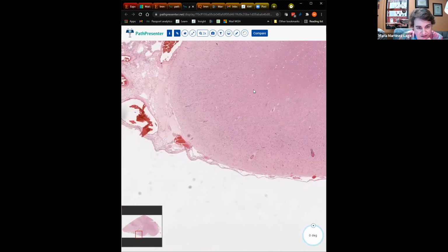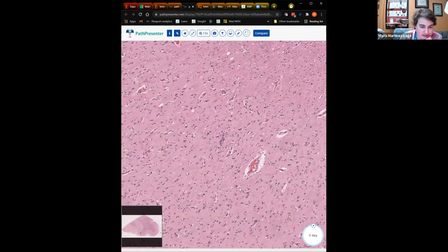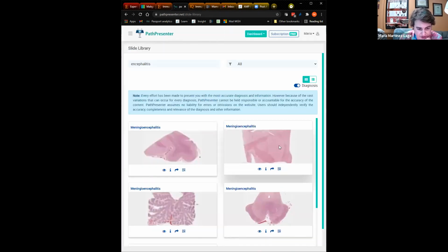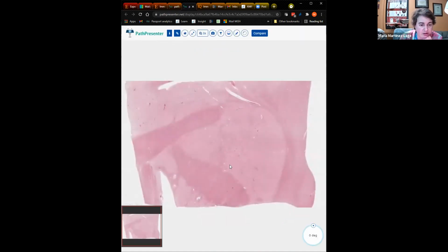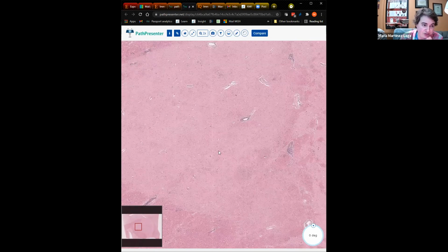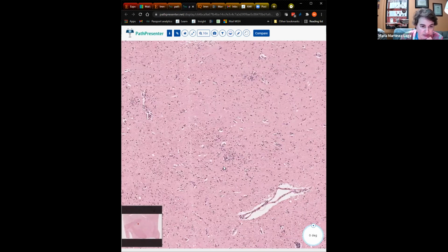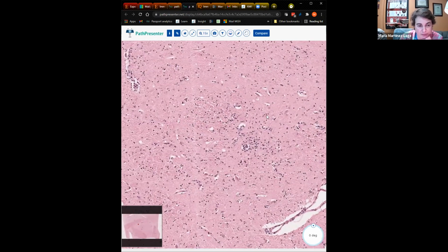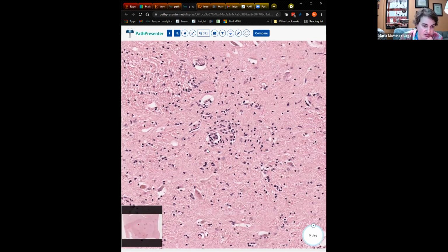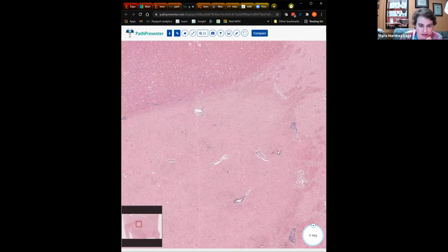One of the main differential diagnoses in chronic encephalitis is going to be autoimmune encephalitis, and occasionally those are going to share a lot of the features. So it's not always clear cut whether a process is viral or autoimmune by just looking at the histology. That's why these usually do need a lot of workup, including PCR, to rule out some virus as the etiology. We do immunohistochemical stains when we're trying to look for that.